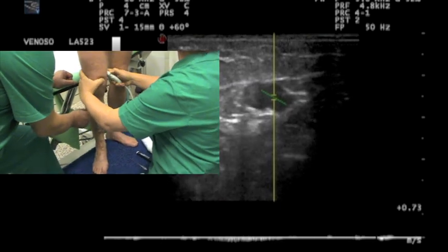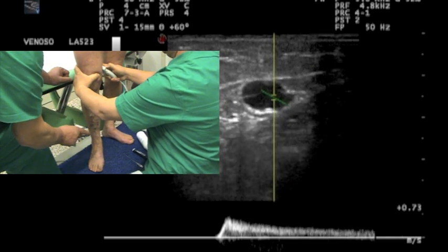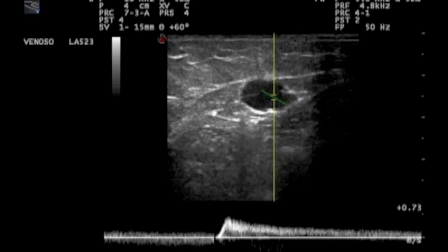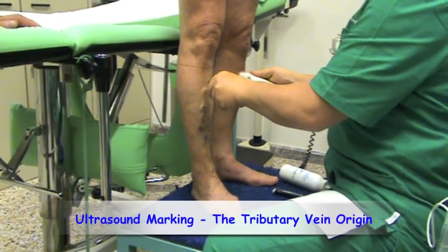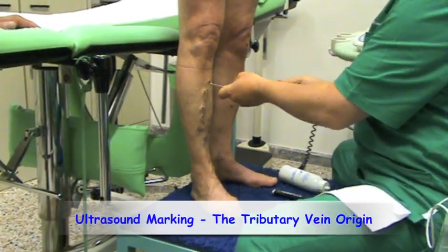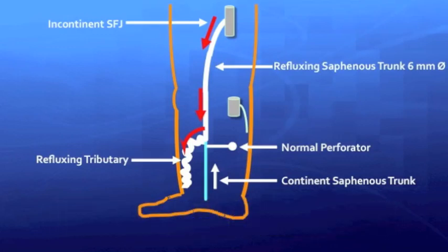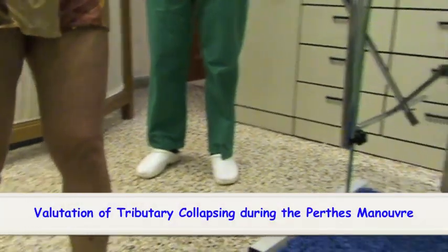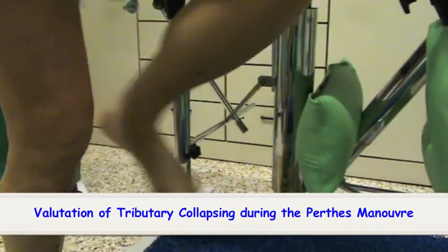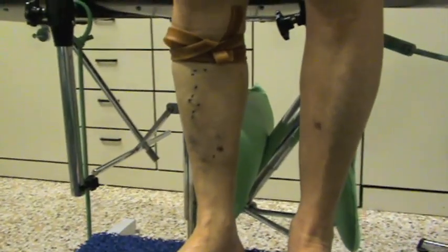The retrograde saphenous flow is stopped by tributary compression and flows again when relaxed. In order to avoid useless phlebectomies, we make sure that the tributary collapses during the Perthes maneuver.